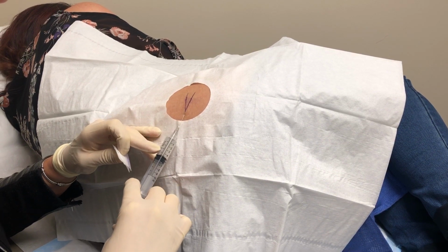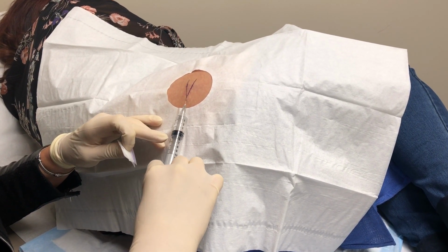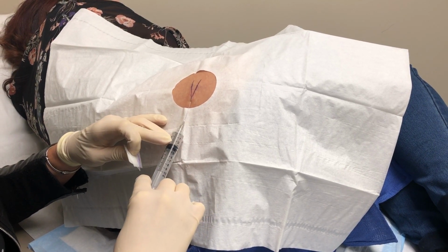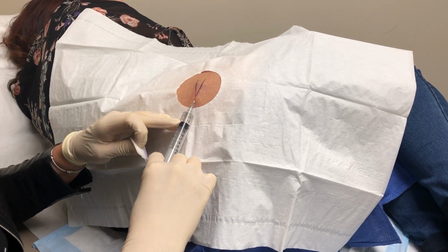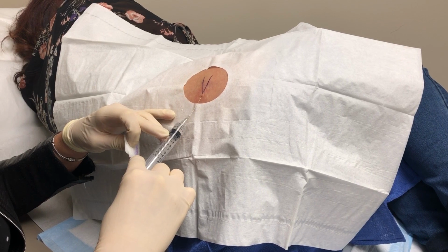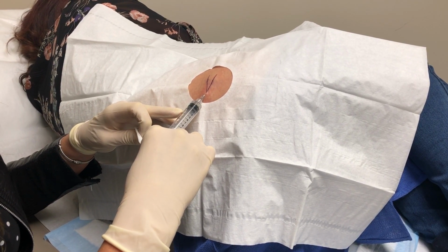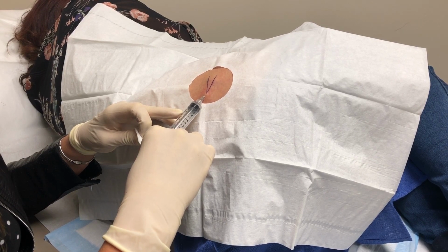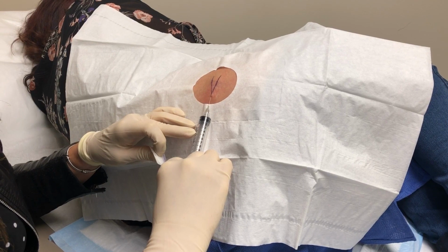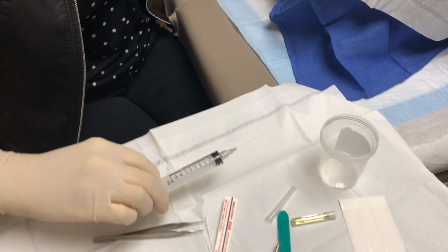And when we're doing female pellets, the area that we select is fairly small like this. When we're doing male pellets, the area is significantly larger, probably 3 times the size, just because the dose of male hormone is significantly larger than it is for females, and their pellet sizes are significantly larger as well. But I'll show you the size of that pellet in just a minute so you can see it.